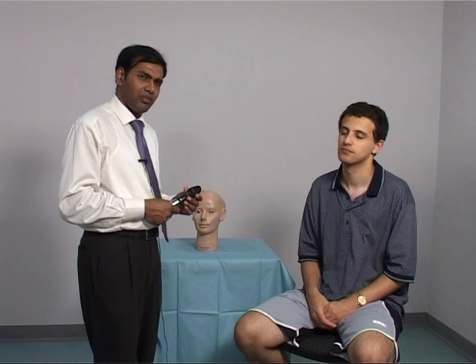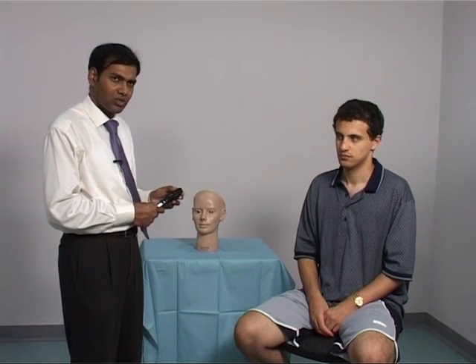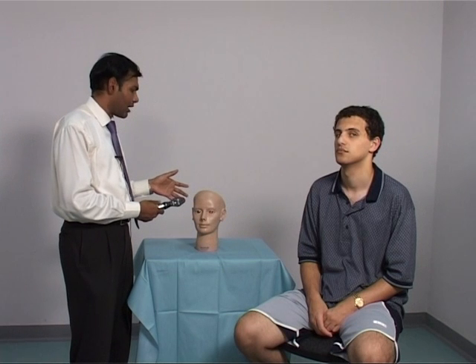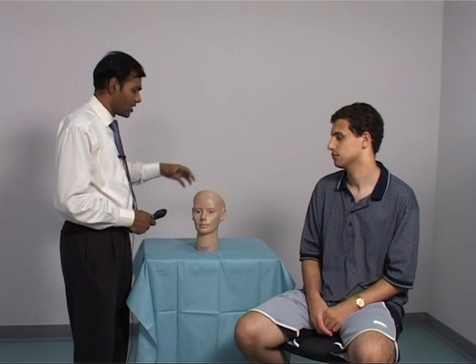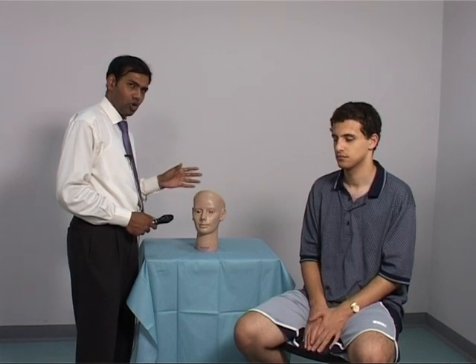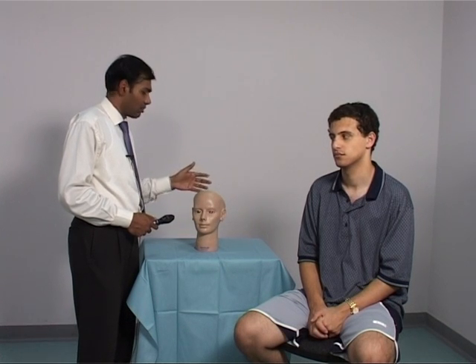Often in the exam, the examiner will ask you to stop at this stage and have a look at the mannequin, which will have abnormal findings or maybe normal findings even. This would be an example of how a mannequin would look like in the real exam. And essentially, the mannequin has slides with abnormal findings or normal looking retina inserted, which is illuminated by a source of light.